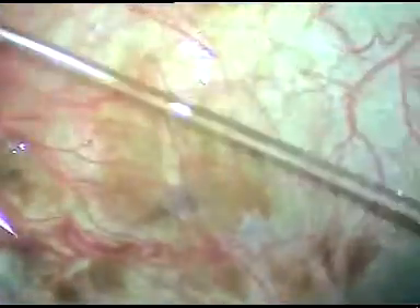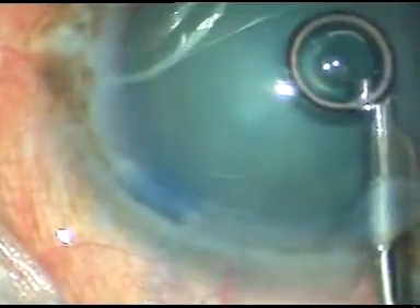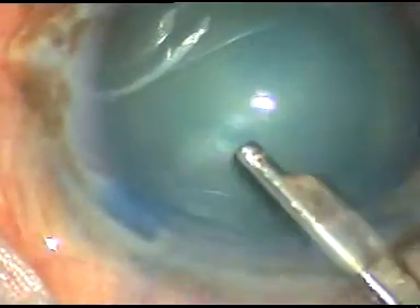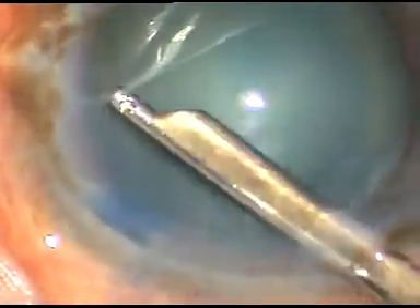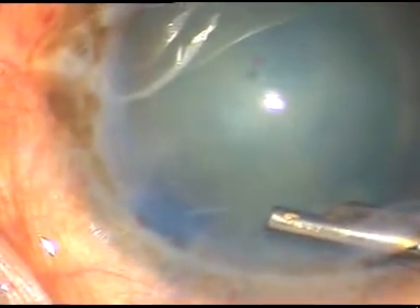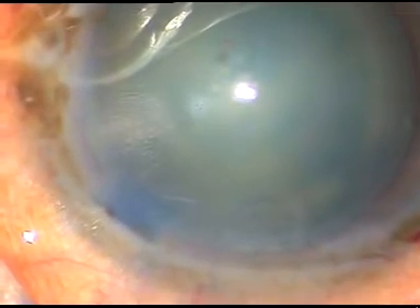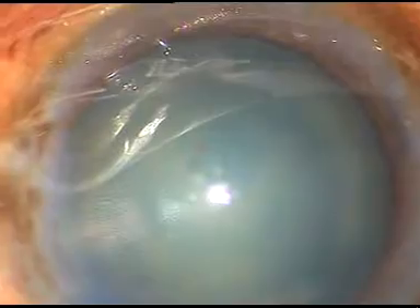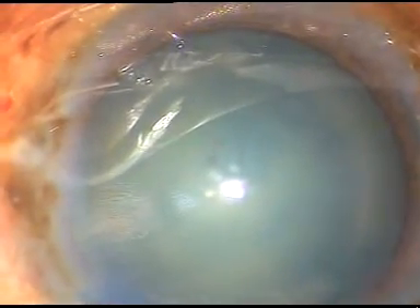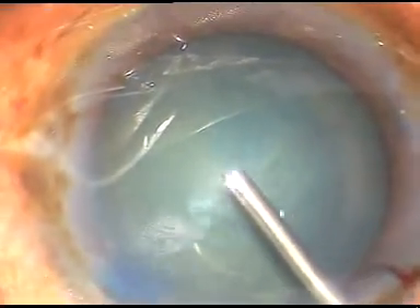The dye is washed out after a few seconds. After washing the dye, I am going to use a viscoelastic substance — an ophthalmic viscoelastic substance. It is HPMC. Here goes the viscoelastic substance — it fills up the anterior chamber.